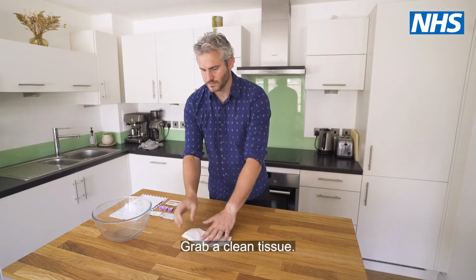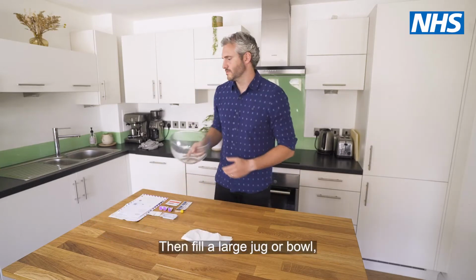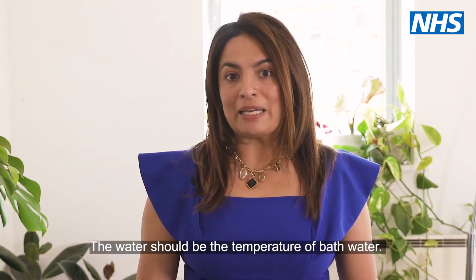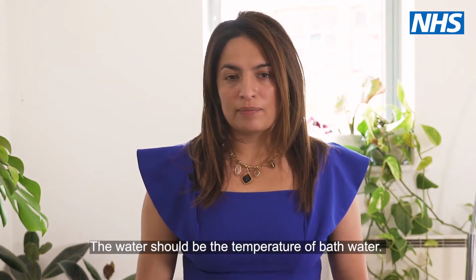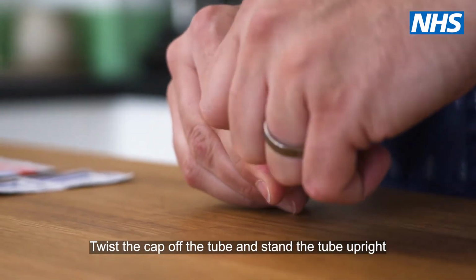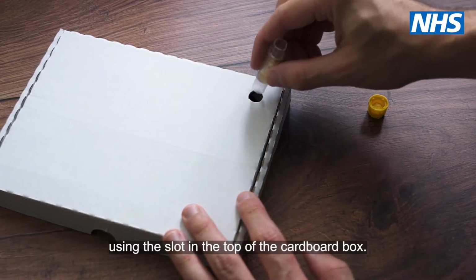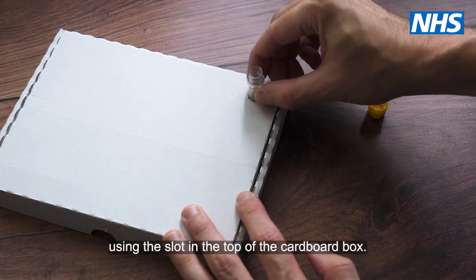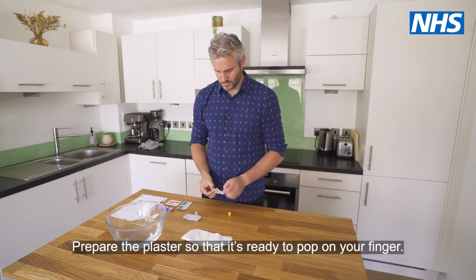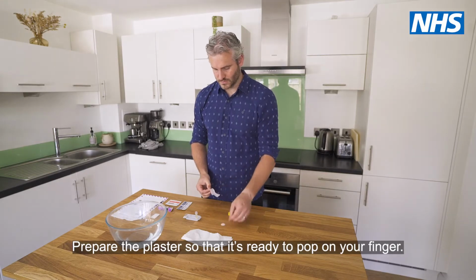Grab a clean tissue, then fill a large jug or bowl, or even your sink, with warm water. The water should be the temperature of bath water. Twist the cap off the tube and stand the tube upright using the slot in the top of the cardboard box. Prepare the plaster so that it's ready to pop on your finger.